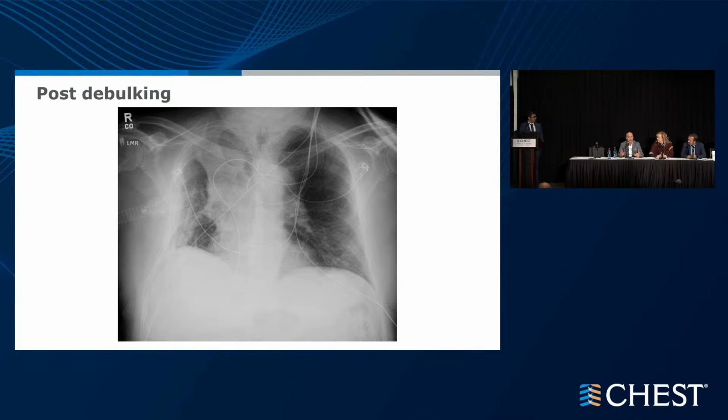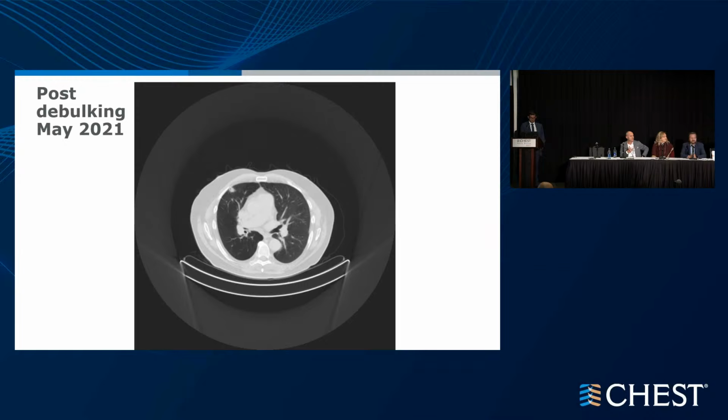So I find the evidence to justify my practice, but if you do leave a foreign object in the airway, especially if you start treatment and all, it will make sense to do surveillance. It's also important to have the follow-up. So after they finish their systemic therapy, if they've gotten an excellent response, the stent should come out if it's no longer necessary, and that frees the patient up also, all the better for that reason. All right. So I'll move on to post-debulking.